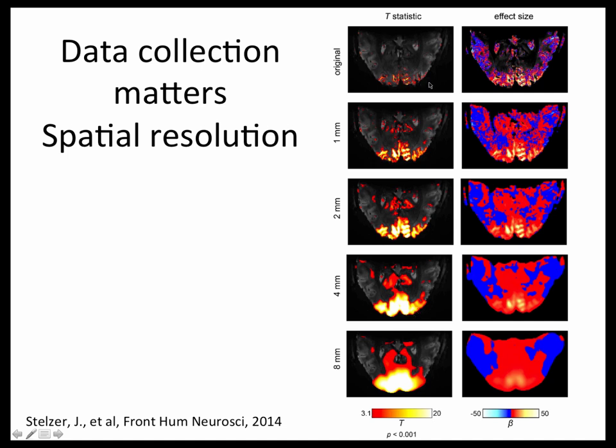In this case they were trying to map cortical columns, and the columns are very visible in the high resolution, but once you get to big voxels, you see a big blur. So here we know this is ground truth, and this is just smoothed out ground truth, but if you're collecting this type of data or this type of data, you're losing that information. So this is going to affect both what you consider neural and how you interpret the data.